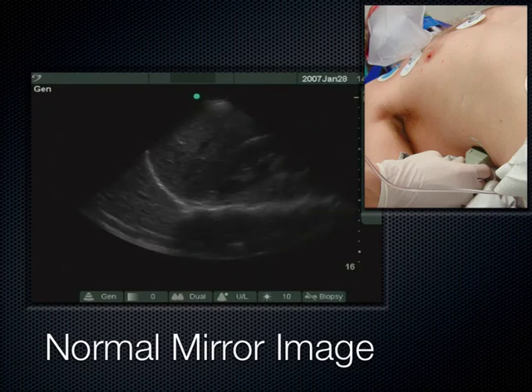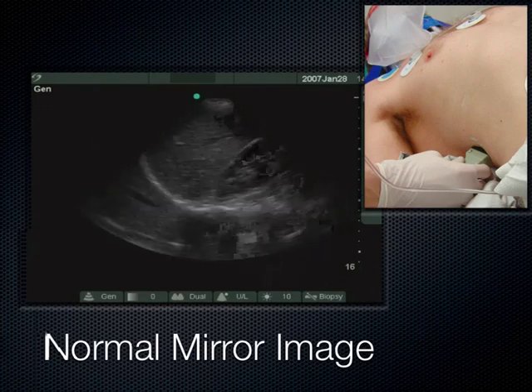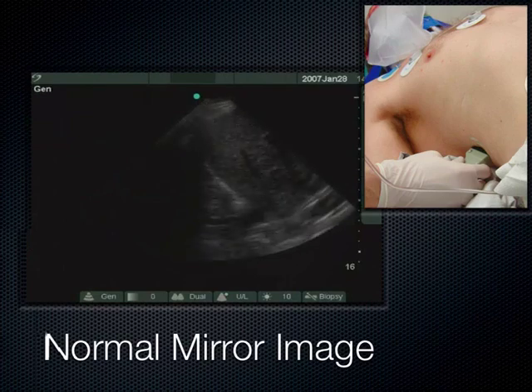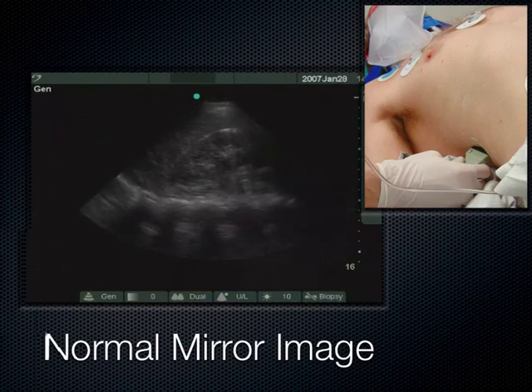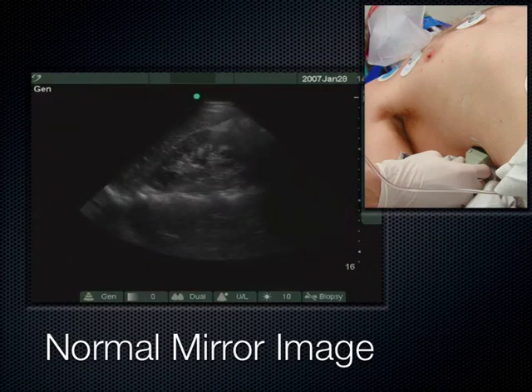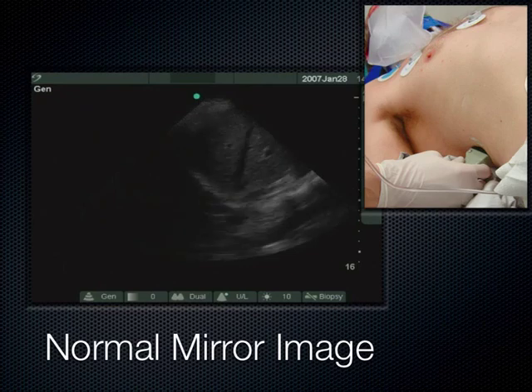Does air conduct ultrasound well? No, because the ultrasound is trying to get through and scatters everything, so you're not going to get a signal from what's behind the lung if there's air. If there's fluid, you'll sometimes, and many times, see the spine continuing further up. Okay, normal or not?